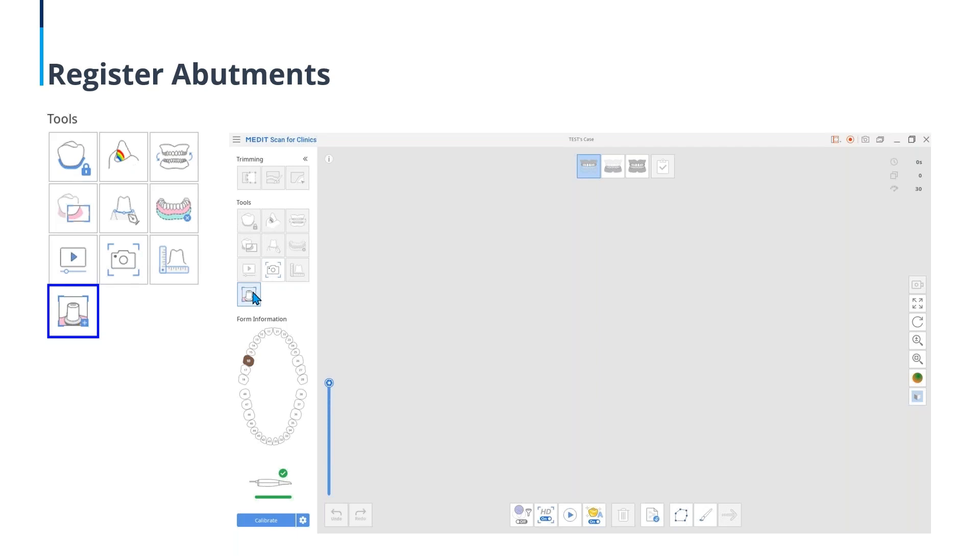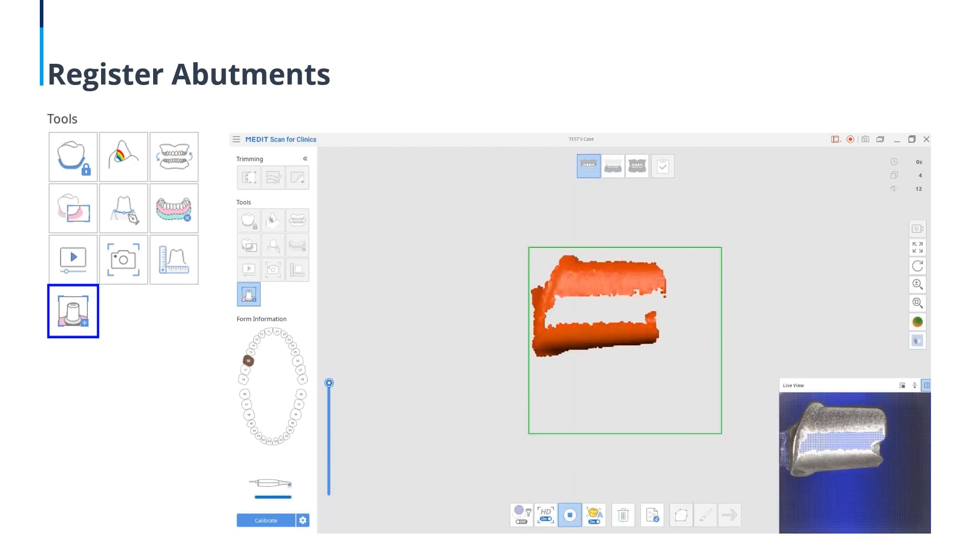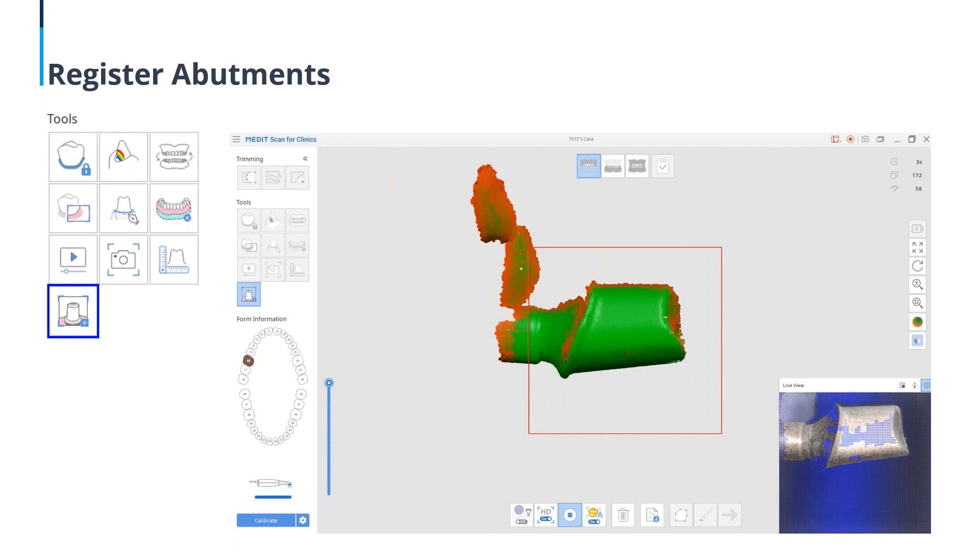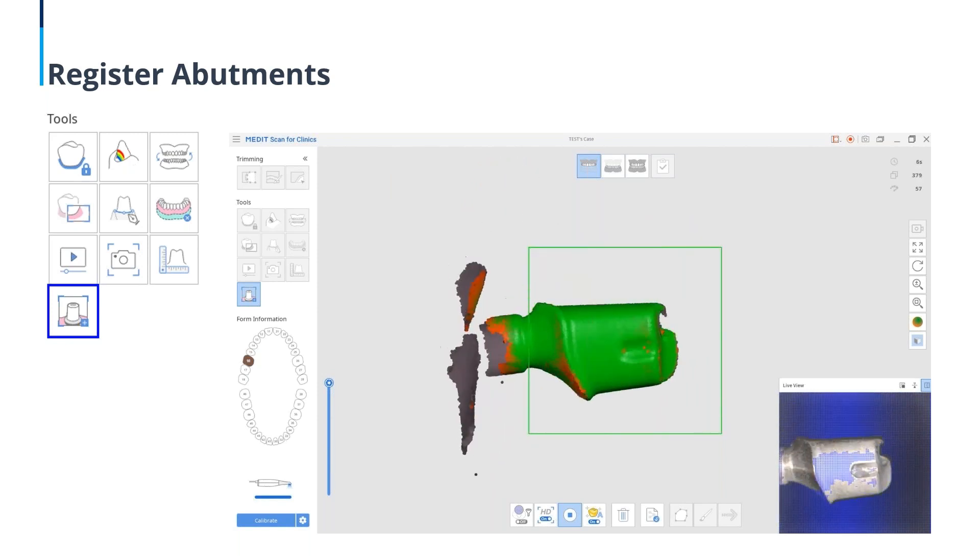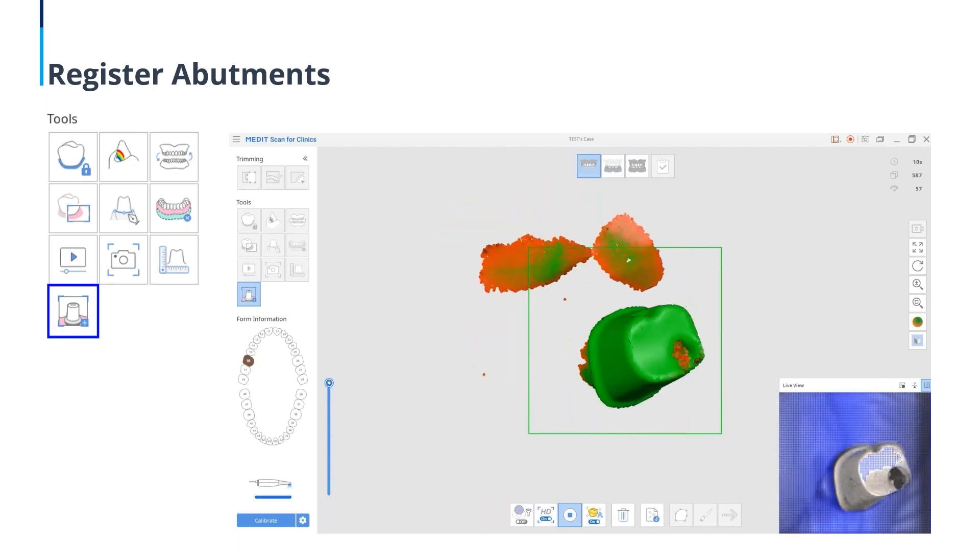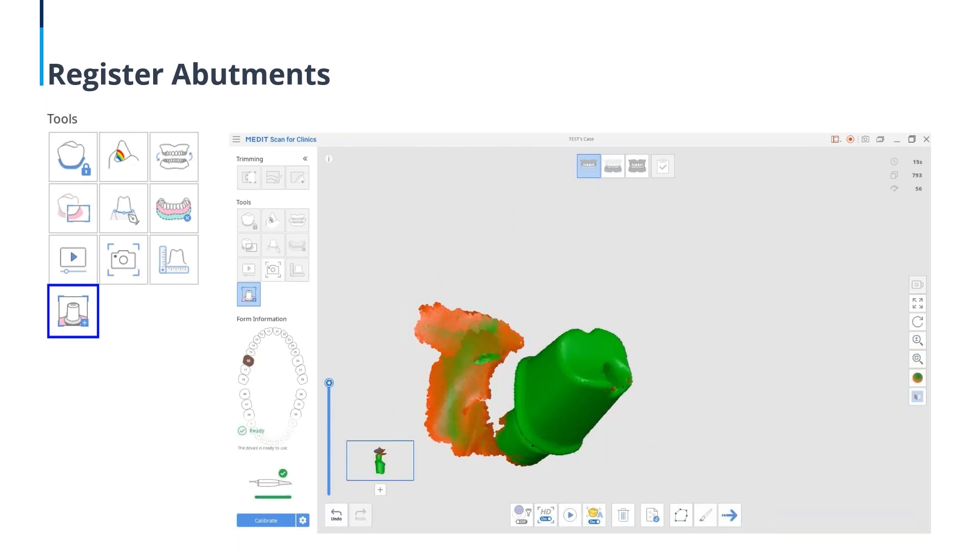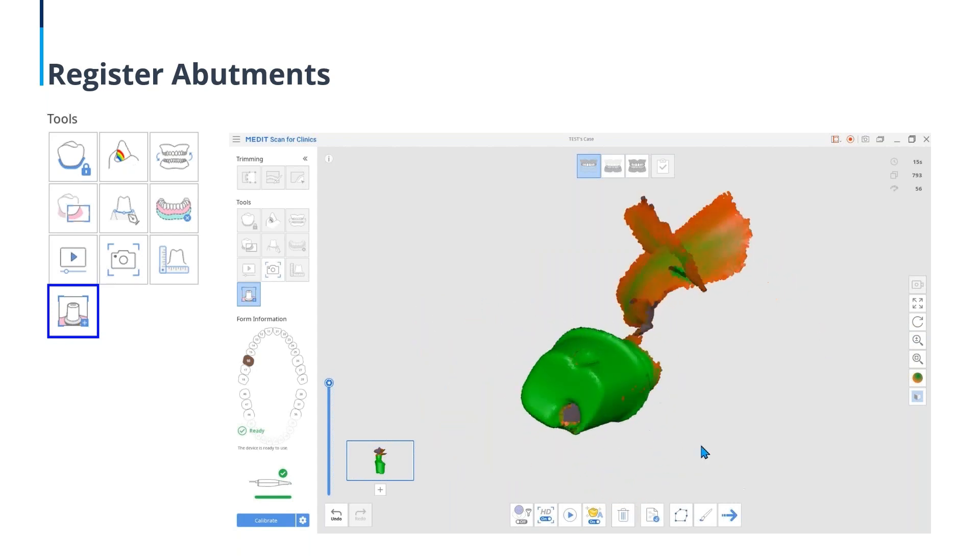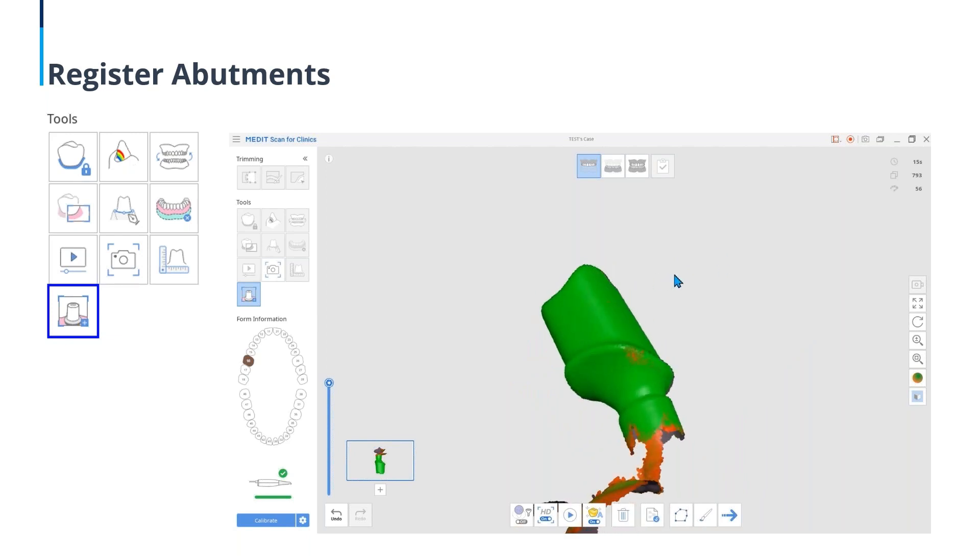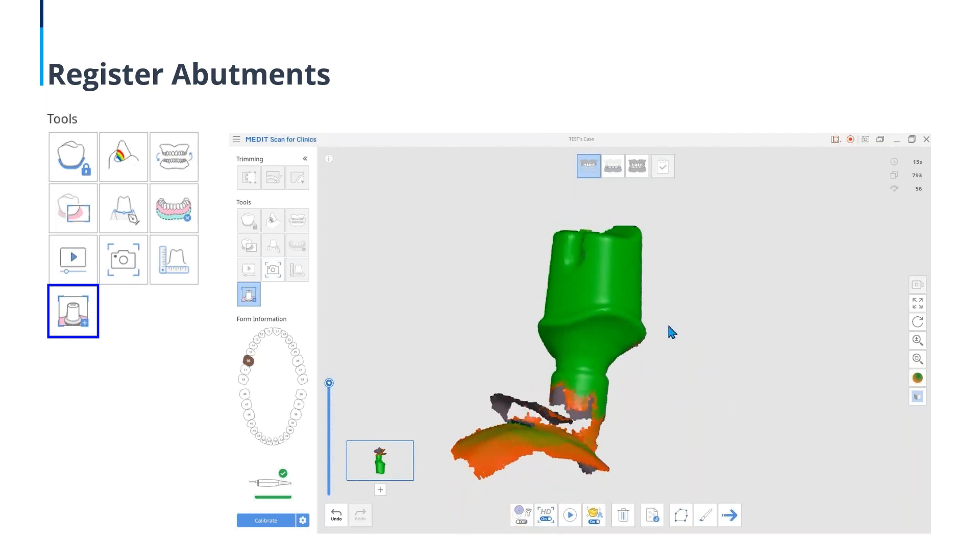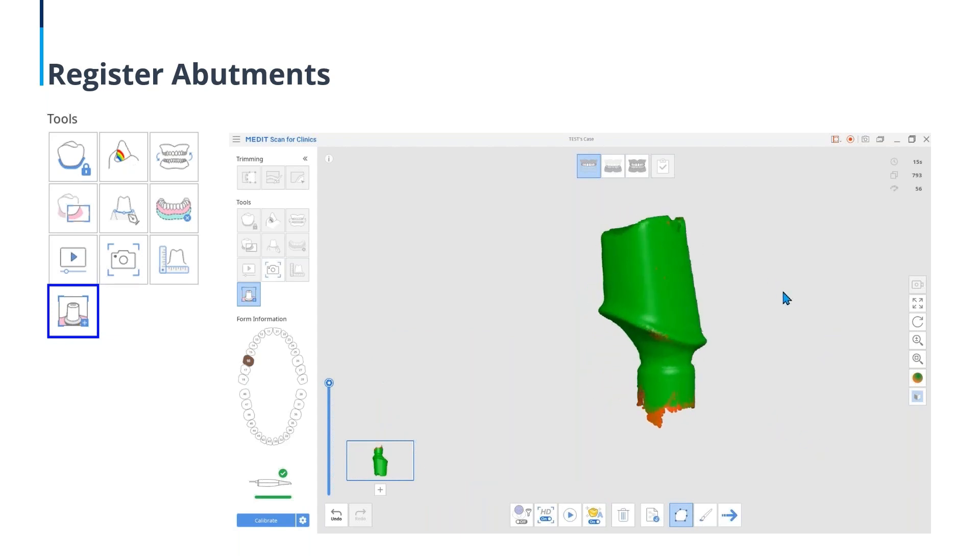What we're going to do is play this video here of how to register an abutment. You're going to see there the icon right below our tools now. It's a new icon that's been added. You're going to click on register abutments there. And then from there, you can go ahead and scan the abutment. If you look at the screen in the lower right hand corner, you can see that someone's actually holding that abutment and it's being scanned with an intraoral scanner. You can see that they're going to get a thorough scan of that abutment. After we're satisfied with the scan, we can go ahead and trim away any unnecessary areas. We're going to select the cutting tool, the trimming tool at the bottom of the screen and right click to delete that. And let's clean up the base of this just a little bit more.